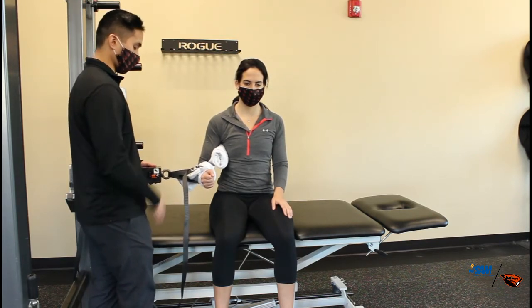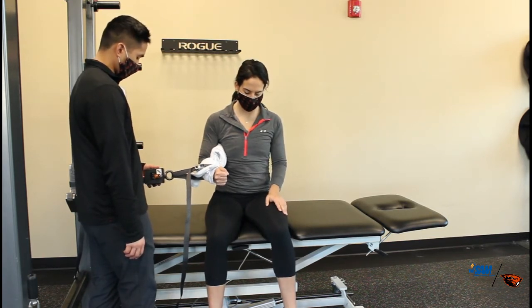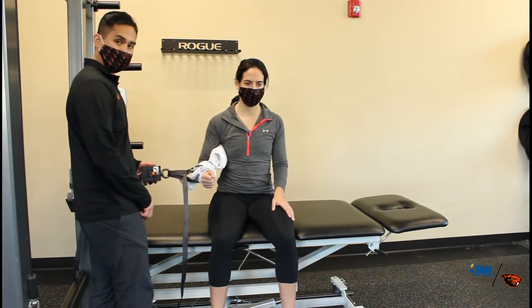Using this device, I'm just going to tell her to push as hard as she can when she's ready. Go for it. Push, push, and rest. I held it for about three seconds. It gives me the peak value, and then I'm going to record that data.